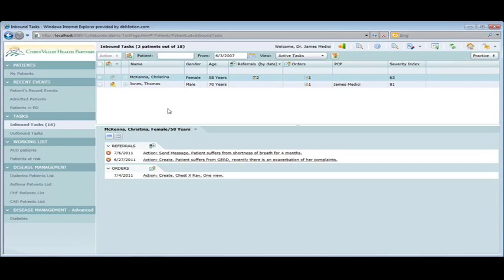as we start doing this collaborative care model. So again, I know there's probably a lot of overlap with other things that you've seen, other Allscripts products. I'll tell you that we're actively trying to figure out where those similarities are, where we augment each other, where we're stepping on toes, and how we can sort of streamline some of this. Yes, Kate? Michael Suleiman asked, are you referring to Care Director? Yeah, so Care Director is another one in particular.